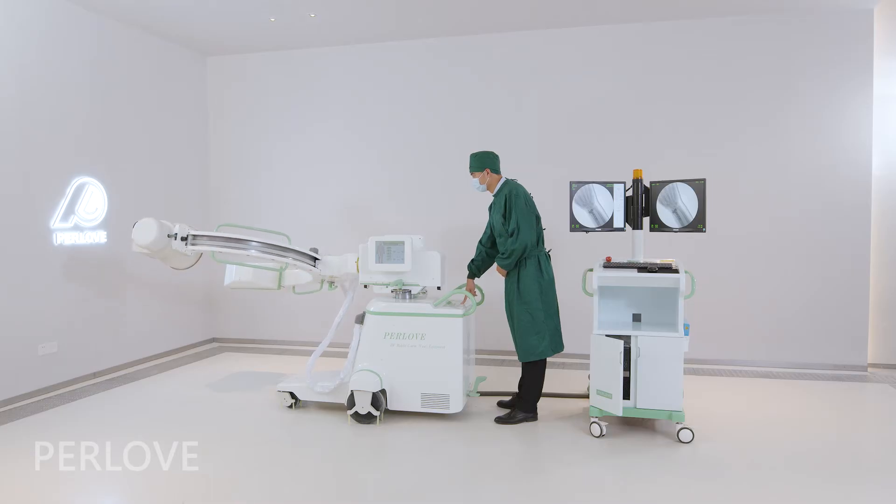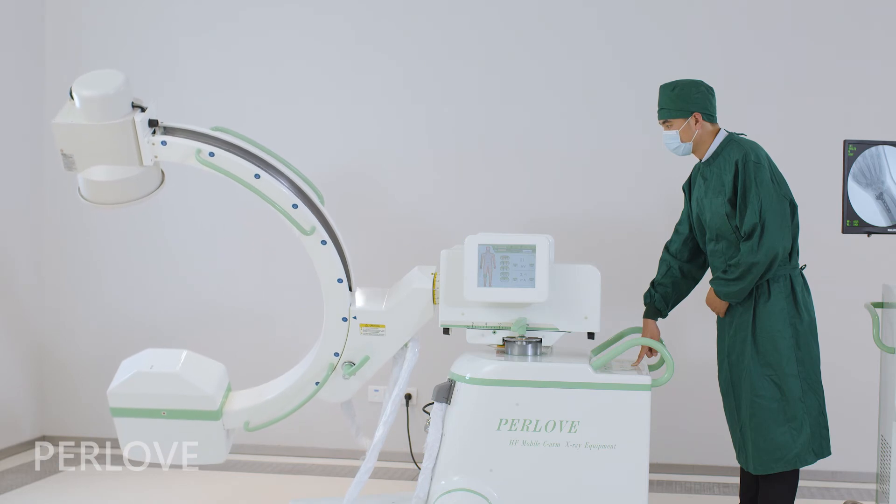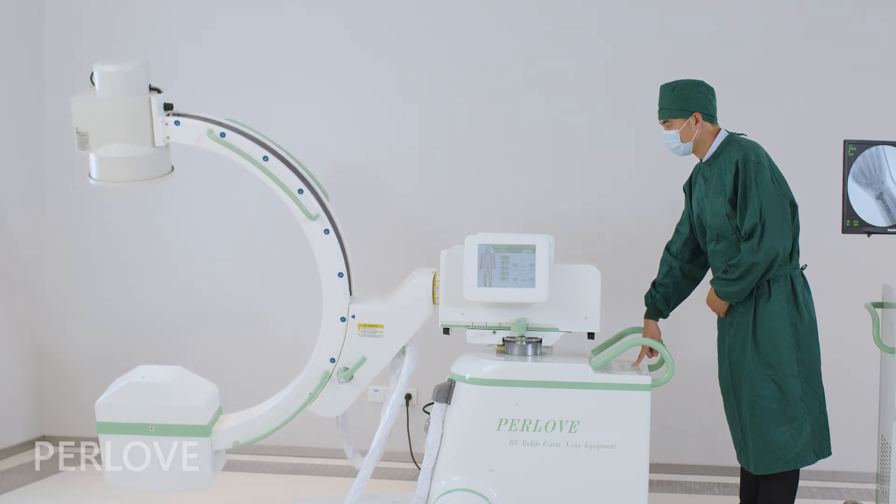The four-dimensional electrical movement design can meet different medical needs and provide an excellent user experience.